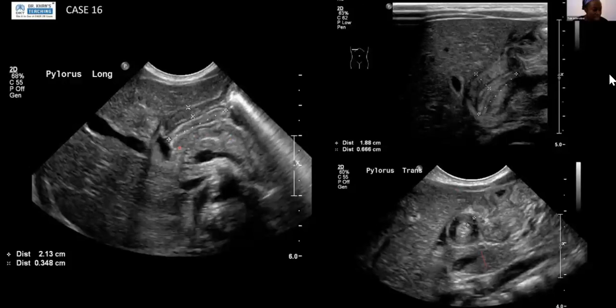So normally you'll see here, it should open, it should separate, and then you should see stuff passing into the D1. Sometimes I'll try and trigger this, so I'll give the child a feed, either water or milk or whatever. I'll ask them to give the child the feed either via the NG or orally, and watch to see if the pylorus opens, because that dynamic assessment really tells you is there a true stenosis, or is everything due to pylorospasm, which I'll come on to.